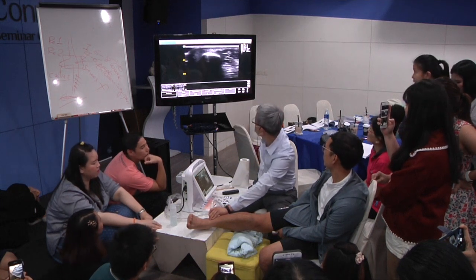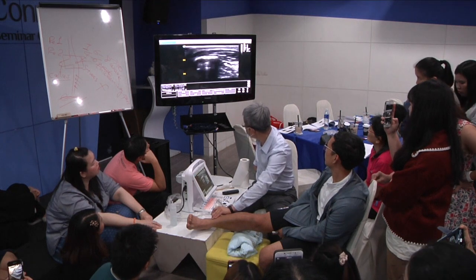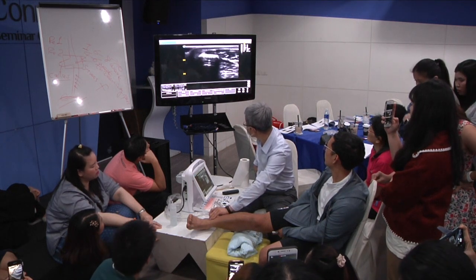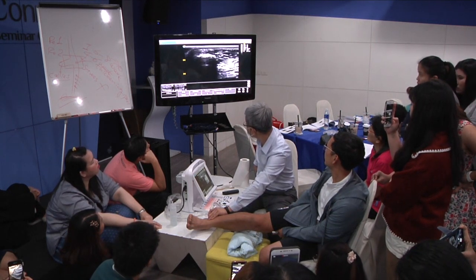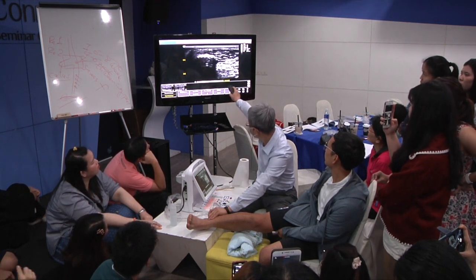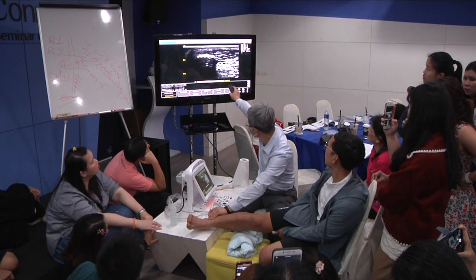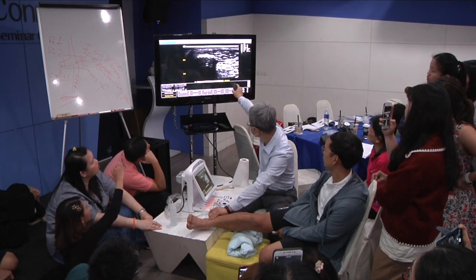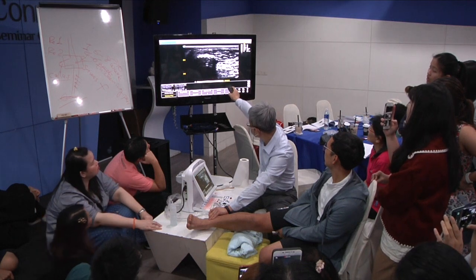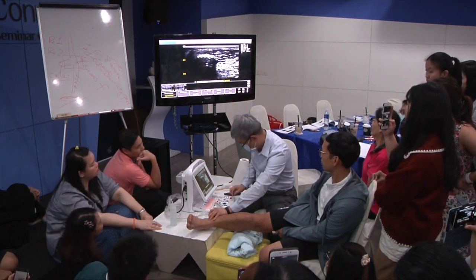That will be a little bit difficult for you to observe. Right. Longus, brevis. Okay.